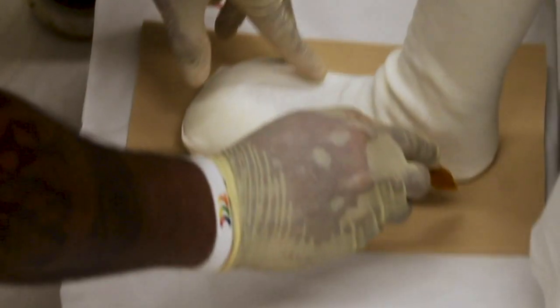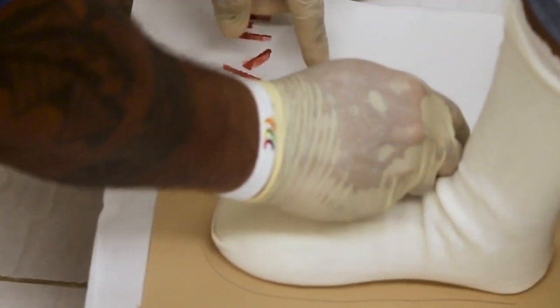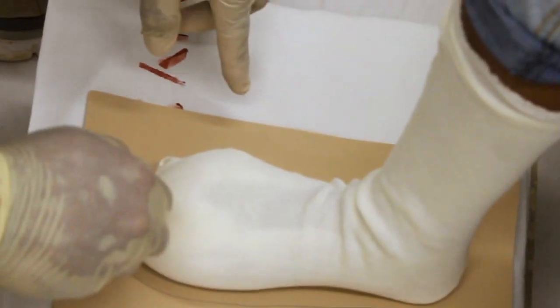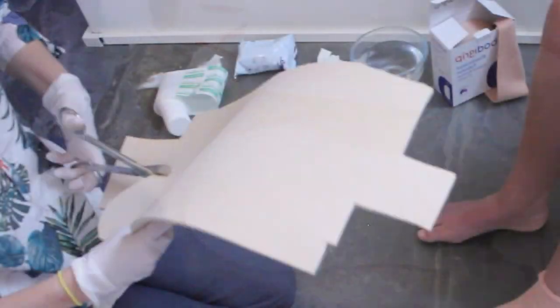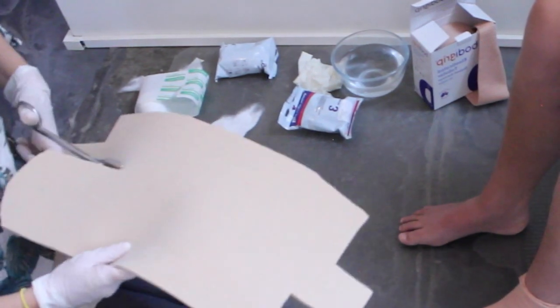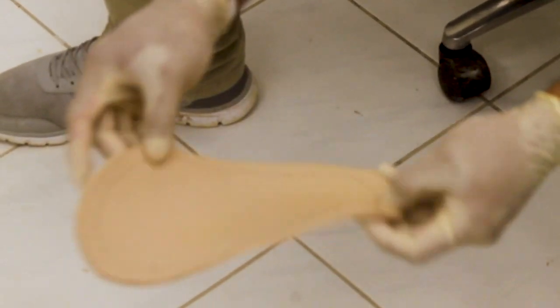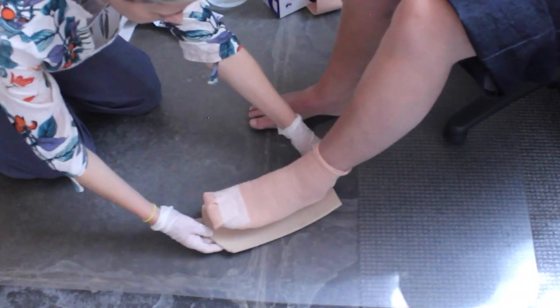On the EVA, trace around the foot leaving enough room for the toes. Cut out the EVA and bevel or smooth the edges. Using the heat gun, heat the EVA until it is easy to mould. Make sure the EVA is ready to mould and not too hot. Mould the EVA to the bottom of the foot.